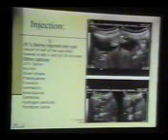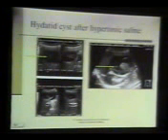Then injection is made. 20% saline is injected into the cyst, equal to half of the aspirate. The needle is left in situ for another 30 minutes. There are other options reported in the literature: 30% saline, alcohol, silver nitrate, praziquantel, formalin, ivermectin, albendazole, cetrimide, hydrogen peroxide, and povidone iodine. People have been using all of these, but my experience is limited to hypertonic saline only.